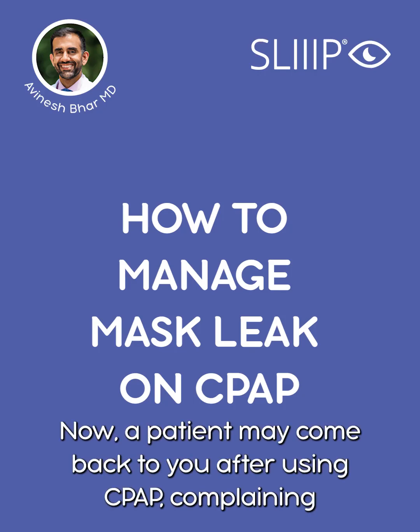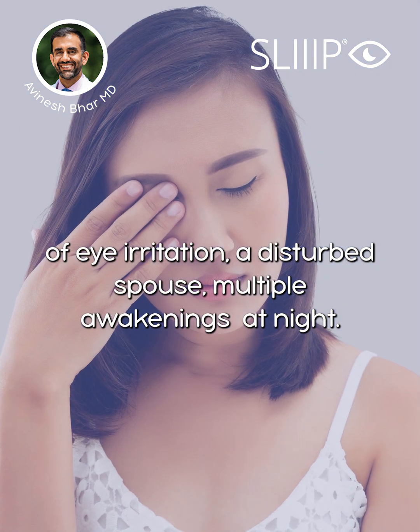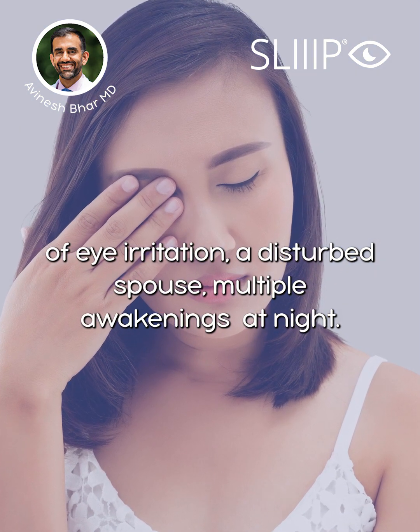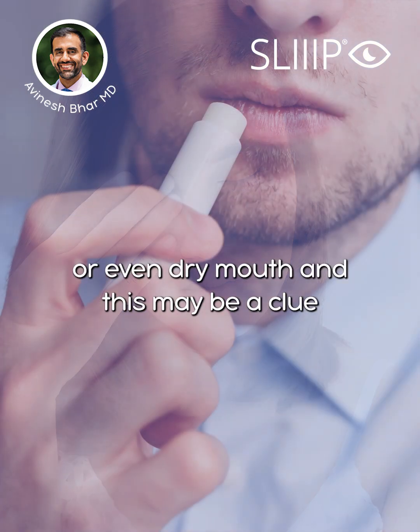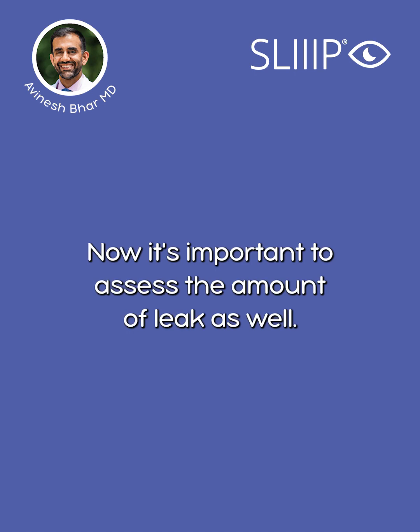Welcome. Now, a patient may come back to you after using CPAP complaining of eye irritation, a disturbed spouse, multiple awakenings at night, or even dry mouth, and this may be a clue to mask leak occurring during the night. Now, it's important to assess the amount of leak as well.